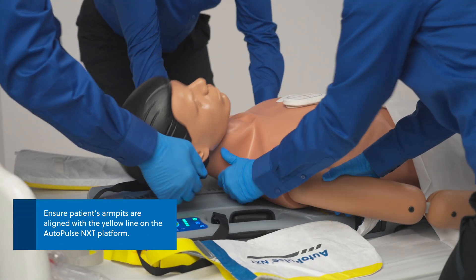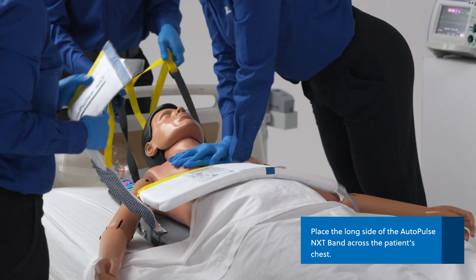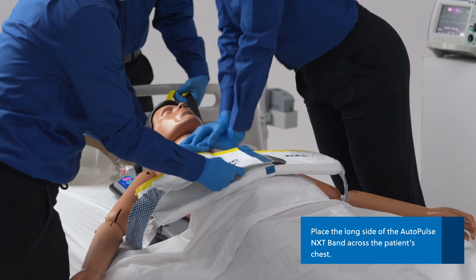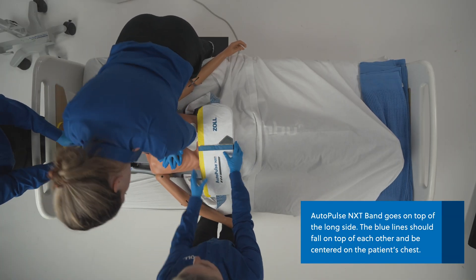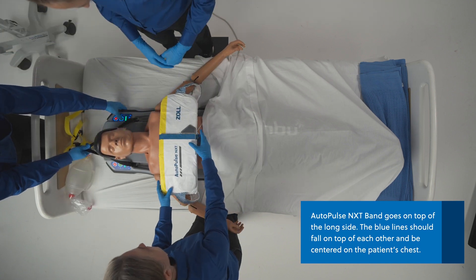Assure alignment of the patient's armpits with the yellow line on the platform. To secure the AutoPulse NXT band, first place the long side of the band across the patient's chest, aligning the yellow line with the patient's armpits. Place the short side with the tab on top of the long side, lining up the blue lines in the center of the patient's body and securing the Velcro.